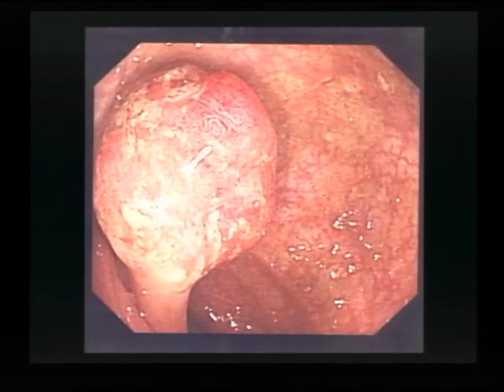So size, morphology, site. So rectum, maybe 1 point. Well, it is 1 point. Cecum, it's getting riskier. That's 3. Okay? So that's about your accessibility and site. Accessibility is the fold. That comes back to your morphology. Depth is where it's depressed. That's your morphology. How deep you assume the lesion is going.